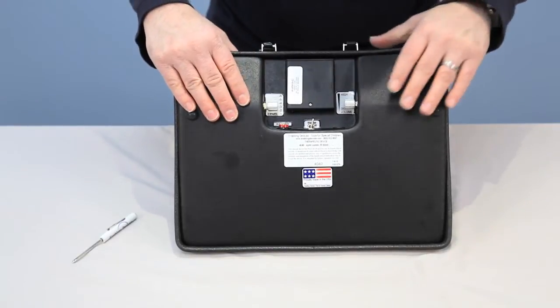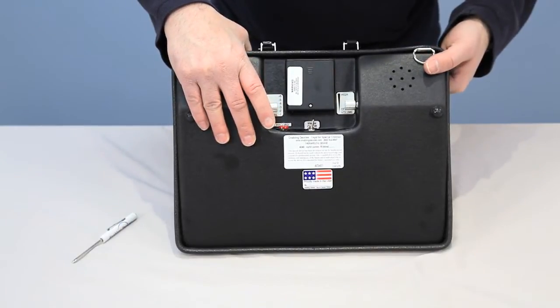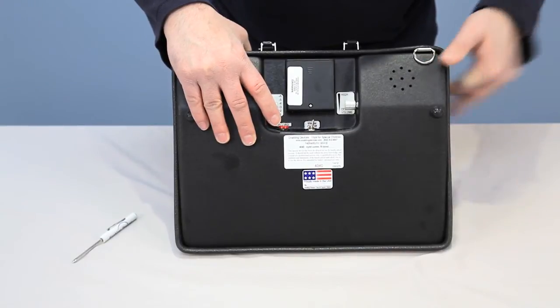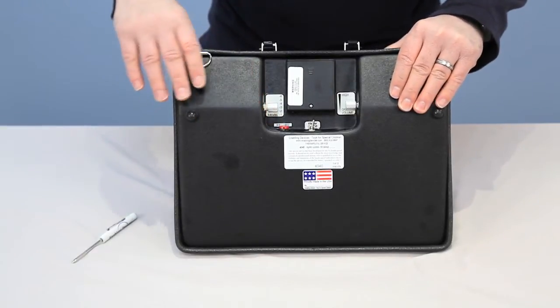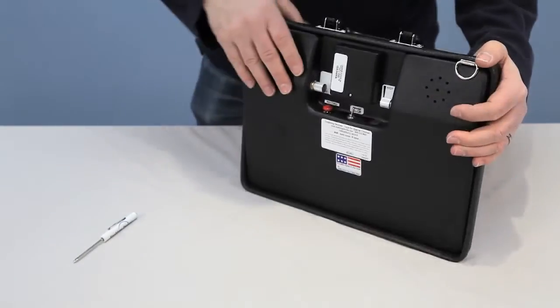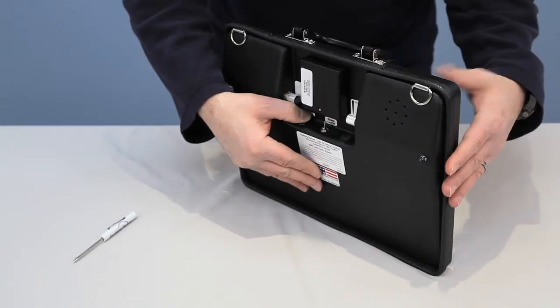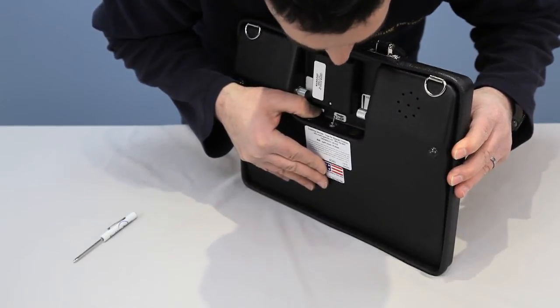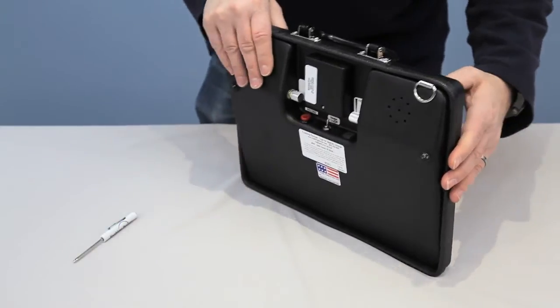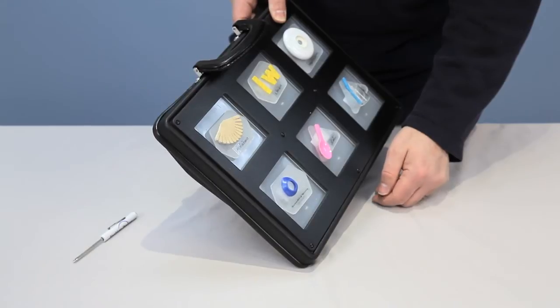To record a message, hold the record button down, then press the location on the front of the machine for the message, speak into the microphone, then release both — that records the message. For example, I'll hold the record button, press the first message location, and say: 'I'm all finished.' Then I release both, turn the unit over, and it plays back: 'I'm all finished.'